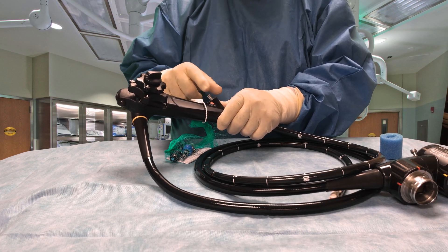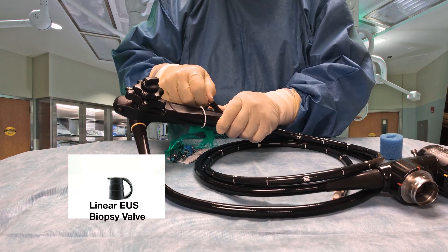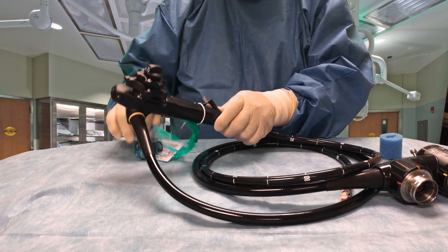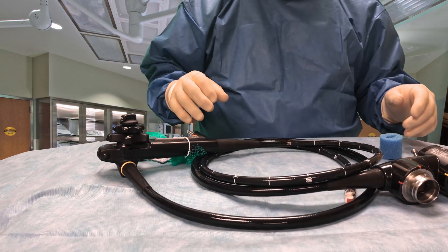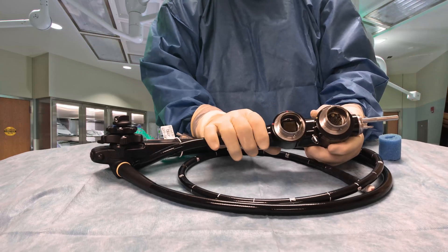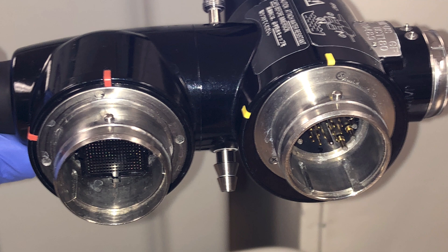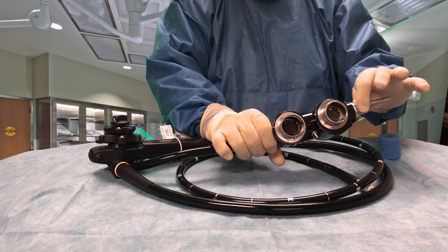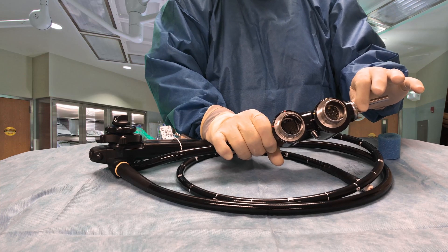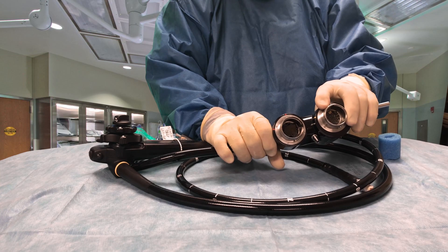This has a little bit different cap on it — the biopsy cap — and that's something we'll get to a little later. This also has two different electrical connectors. The top electrical connector here, closest to the light guide tube, is an electrical connector for the video portion of the scope.